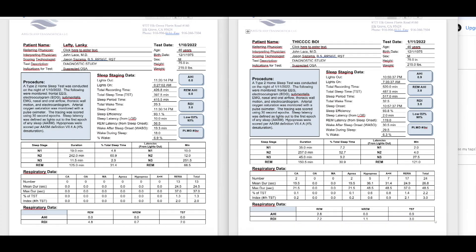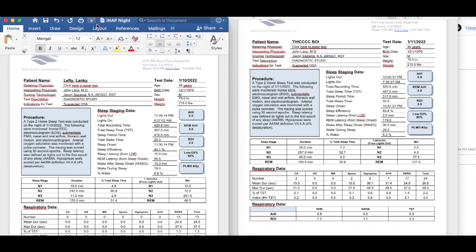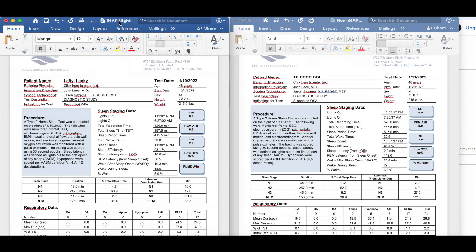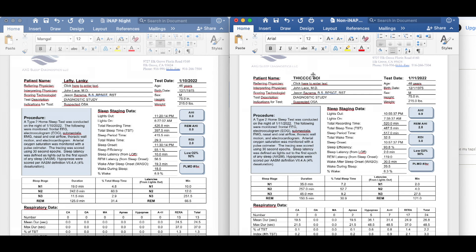All that suffering just to get to these data points. We have on January 10th the patient named Lanky Lefty, and the next day January 11th we have Thick Boy. Both of them are me. This first one on the left is the iNap night, and then we have the non-iNap night. Obviously I'm going to be thicker on the non-iNap night. Let's take a look at these numbers, and then I'm going to tell you something where I think I screwed up — my apologies.